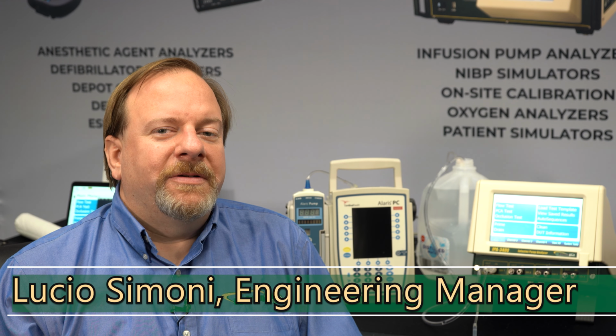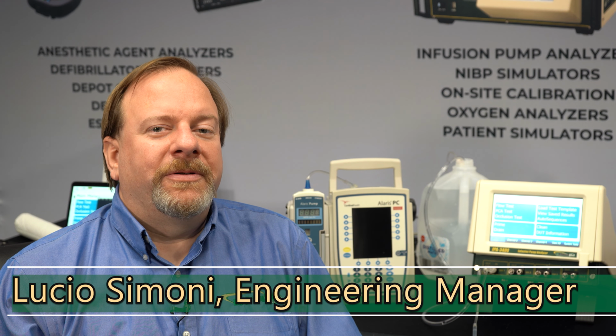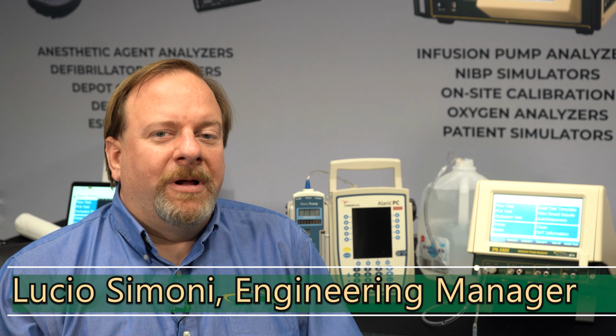In this series of videos, we're going to demonstrate the IPA-3400. We're going to show all of the screens and features of the unit, including flow testing, occlusion testing, and PCA testing. We're going to show how to do auto sequences, how to load test results and save test results, as well as the various operating modes like drain, clean, and prime. We'll also show how to load and exchange the IPA flow modules that are contained inside the unit.